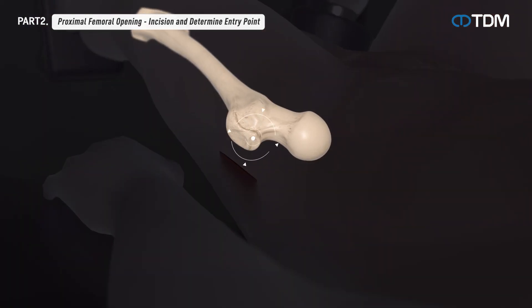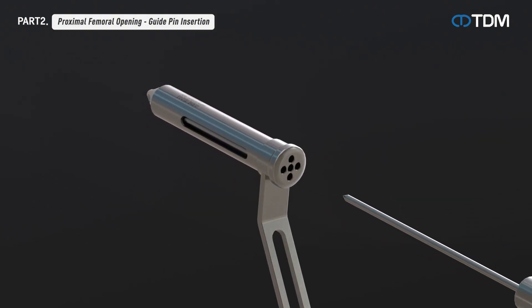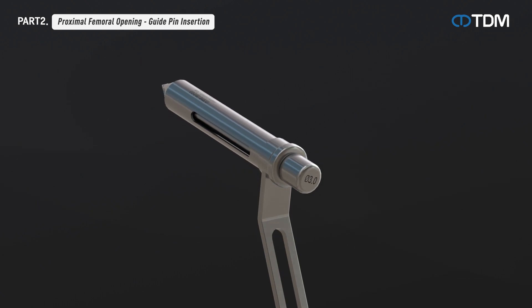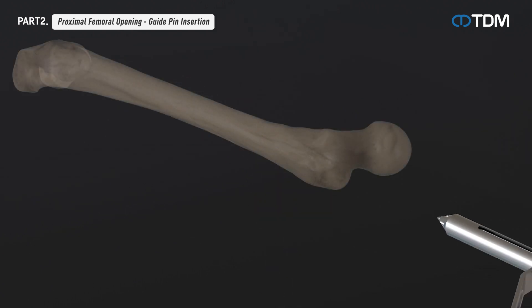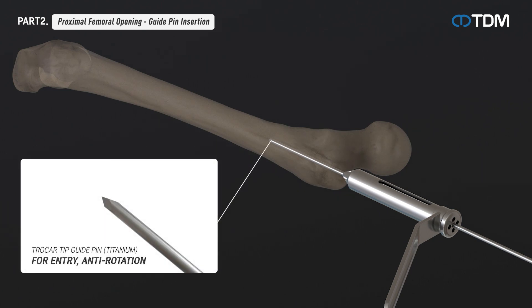Confirm the guide pin insertion location by palpating the tip of the greater trochanter. Insert the instrument — a combination of protection sleeve, drill sleeve, and trocar — into the incision to position the guide pin. Remove the trocar and insert the guide pin combined with the power drill or guide pin holder into the appropriate location.